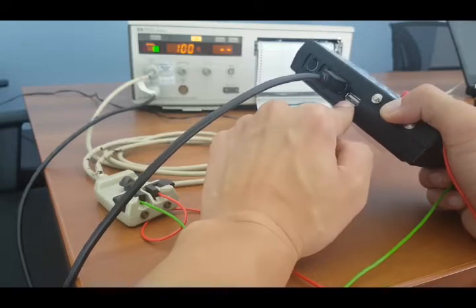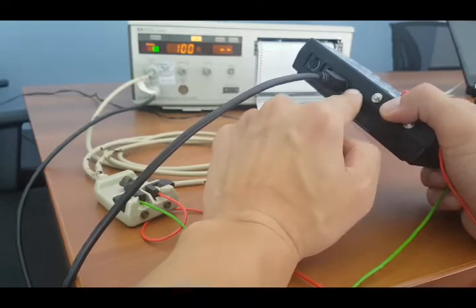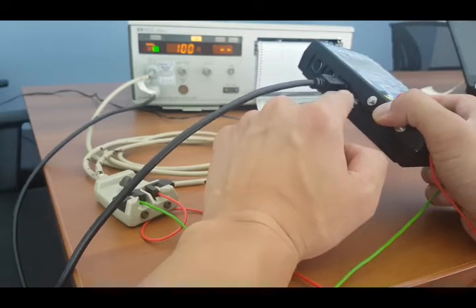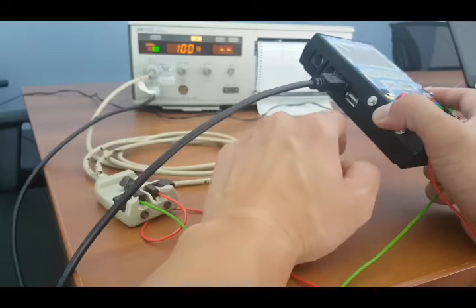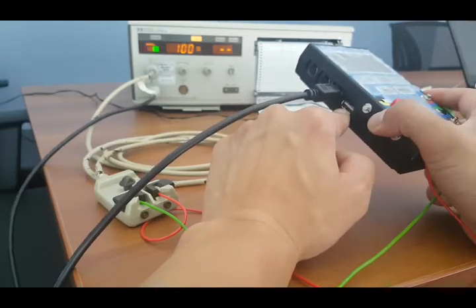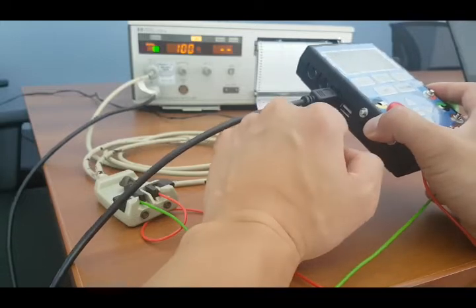We have used the 4 pins from a typical USB as a simple connection or a simple cable to connect to. The other end, of course, will go into the monitor you want to generate or simulate the data or have the data simulated into.